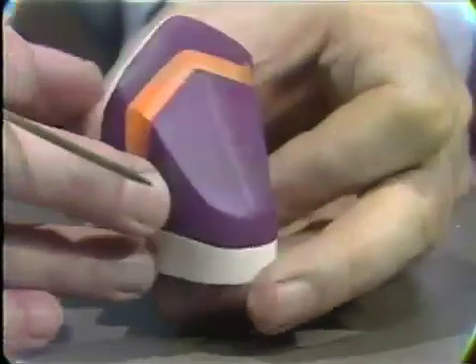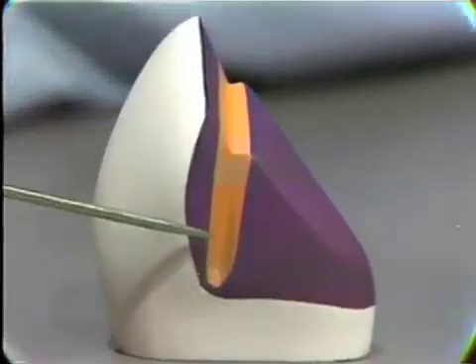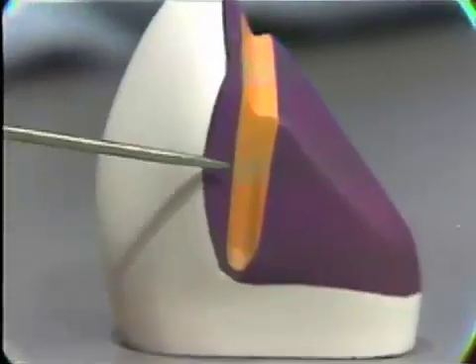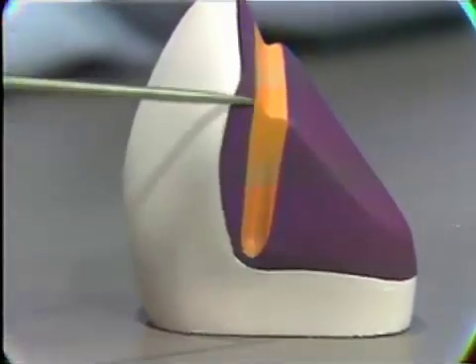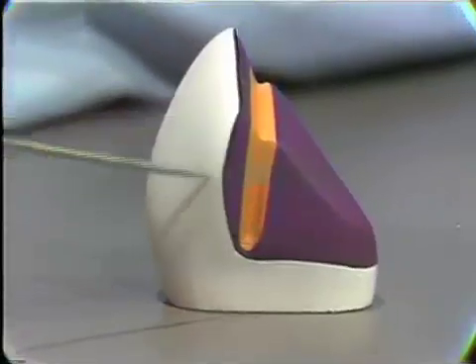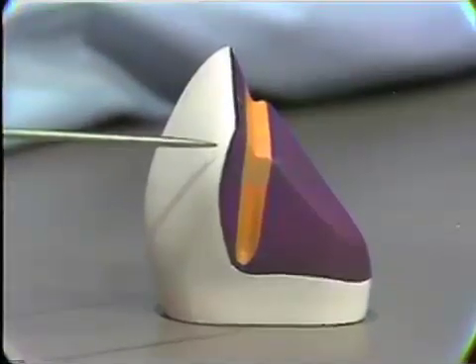Now you can see that in order to get the necessary retention, these grooves have to be of adequate length, they have to be on the proximal surface, and they do to some degree determine the extent of the slice that must be made. And in many situations, having to put a groove here will lead to bringing the gold further forward in this region than you would really like from an aesthetic point of view.